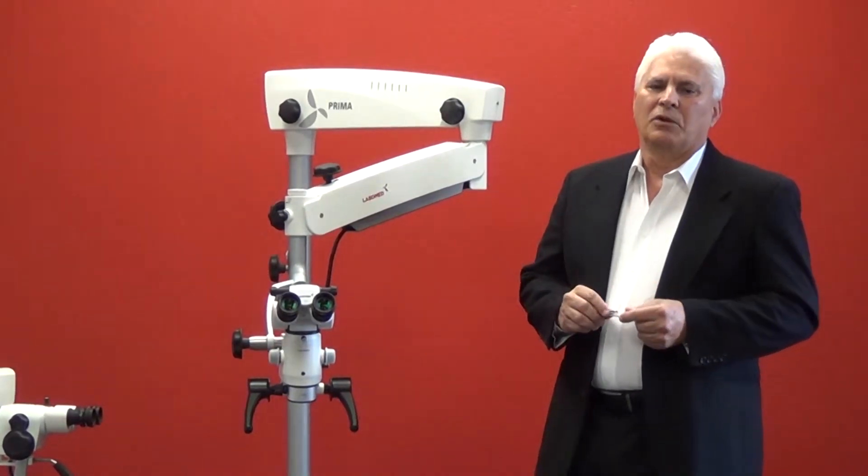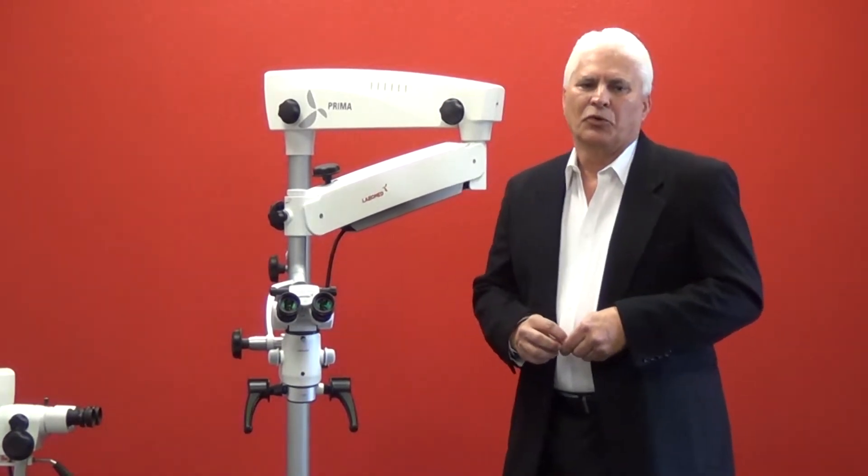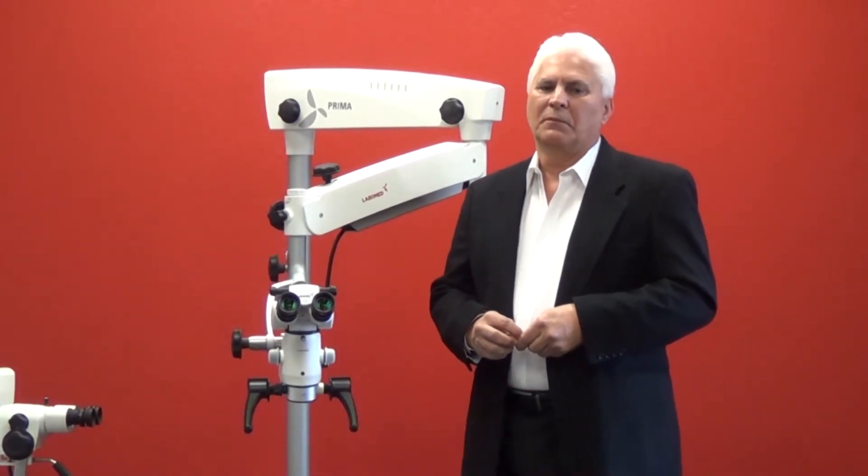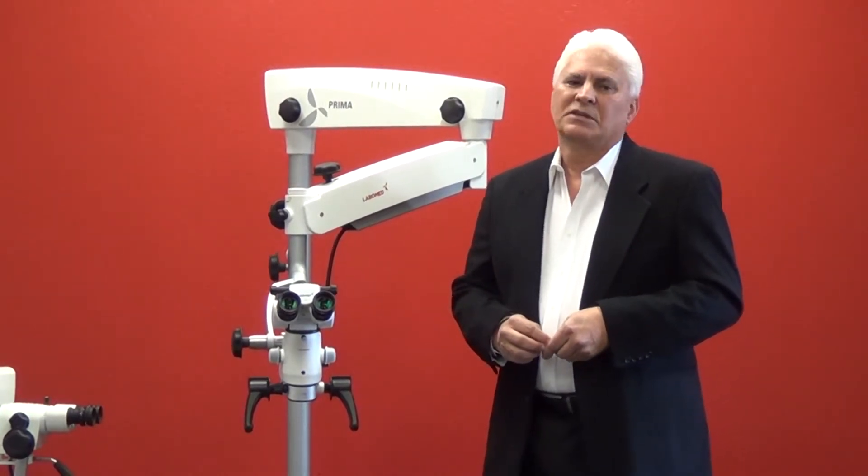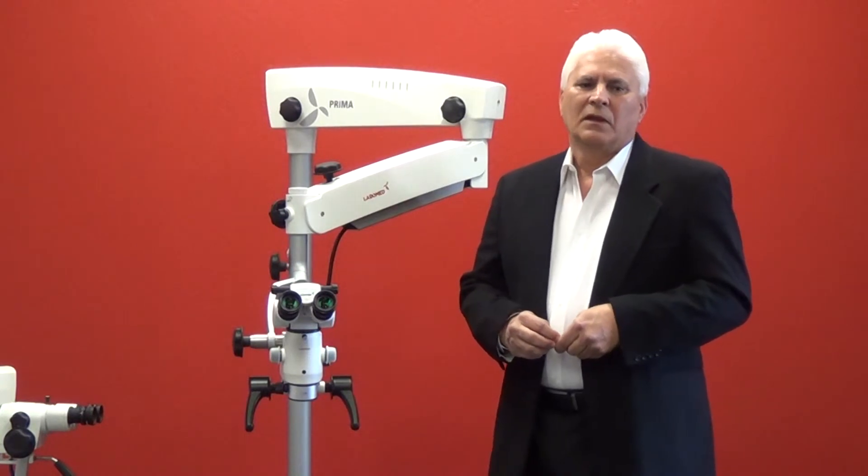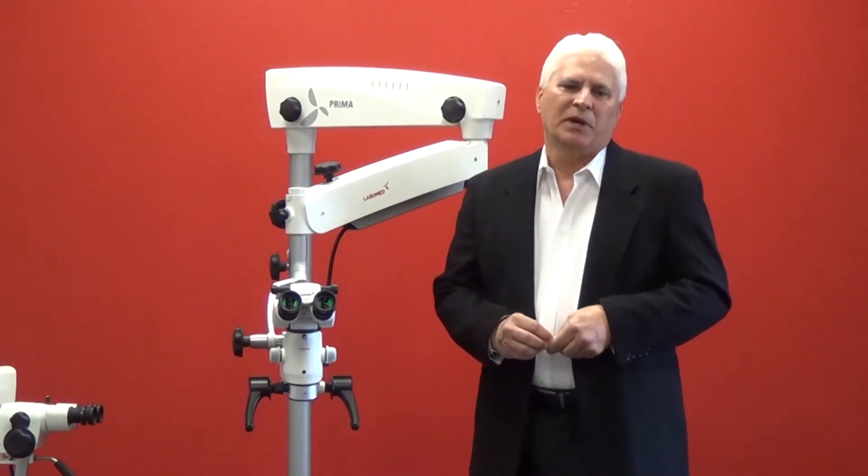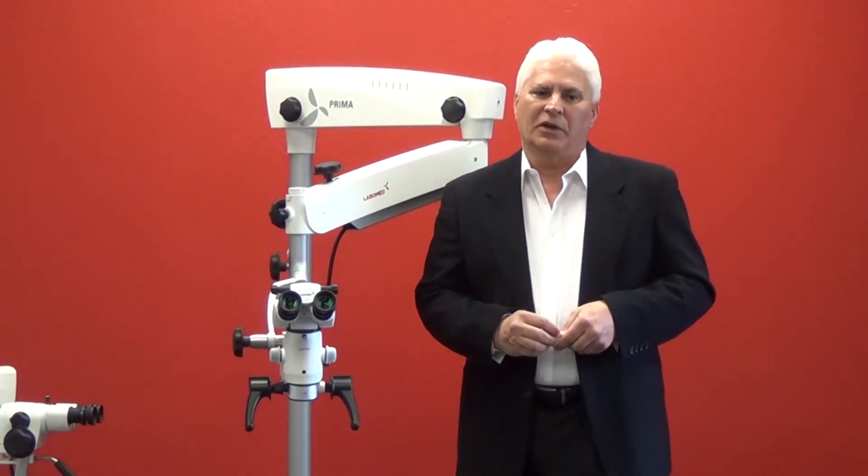Another technology available is Xenon, which produces 80,000 lux, an order of magnitude brighter than halogen, and more ideal for light-hungry applications such as dental and ENT fields. However, once again, bulb life is rated very low at 200 to 300 hours, and bulbs are very costly.